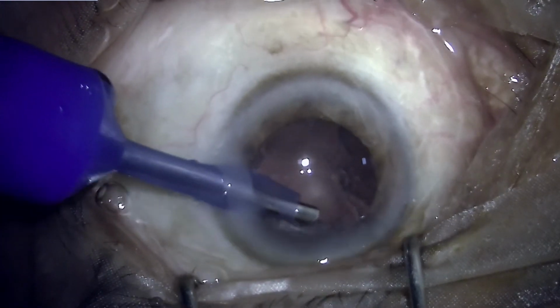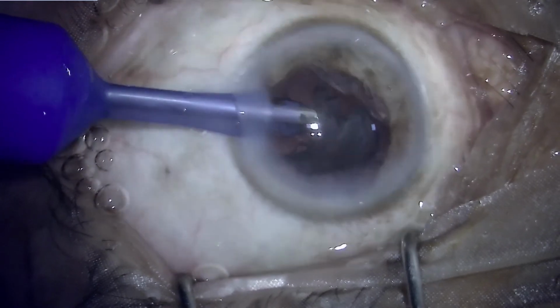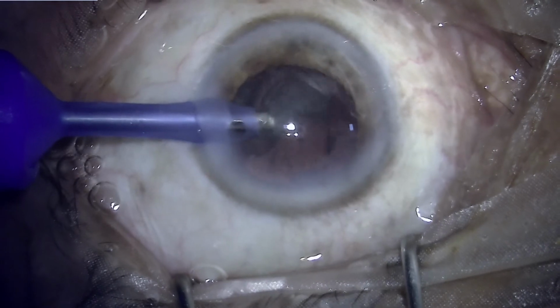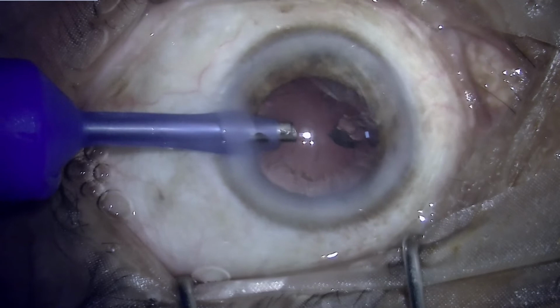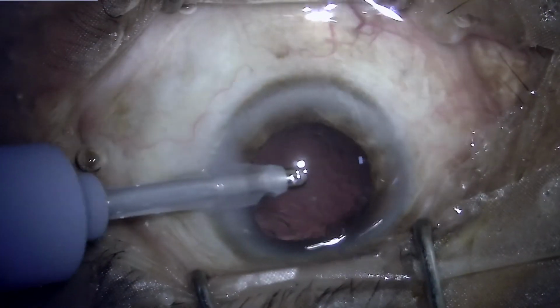So this seemed to be the most appropriate, safe technique for this particular cataract, which is also known as chip and flip. Although this was not the plan, it had to be conducted in this manner just to be on the safer side, avoiding any complication.